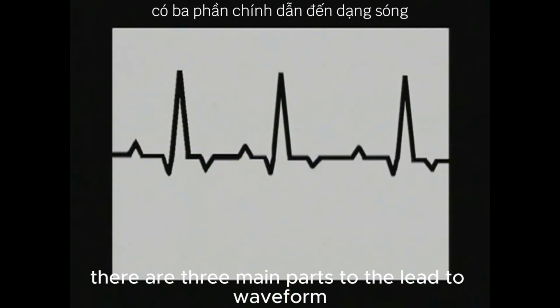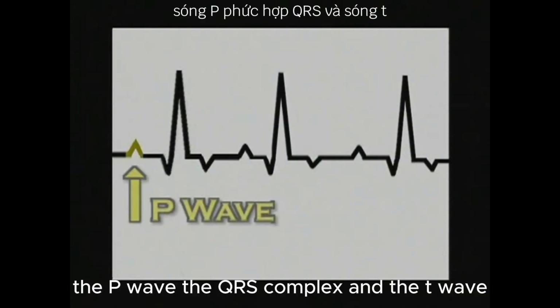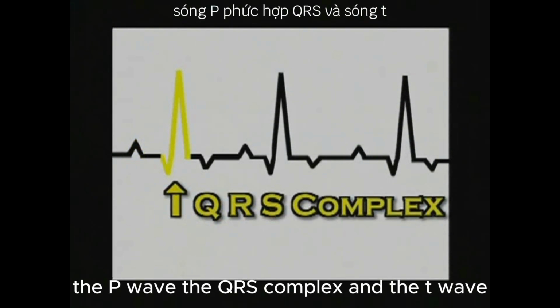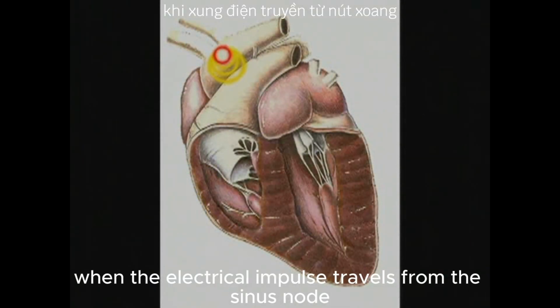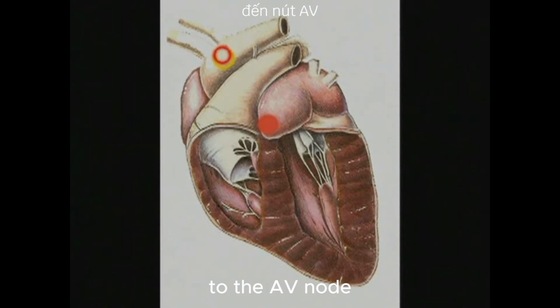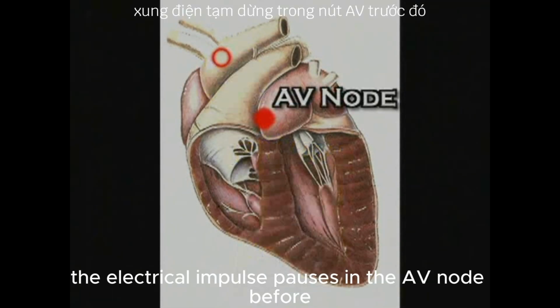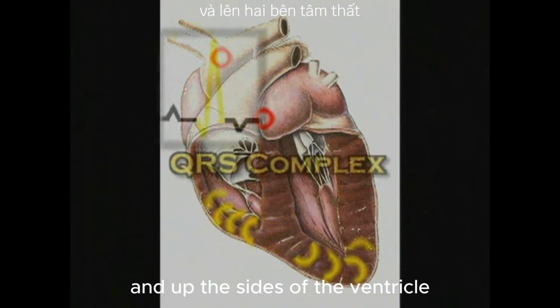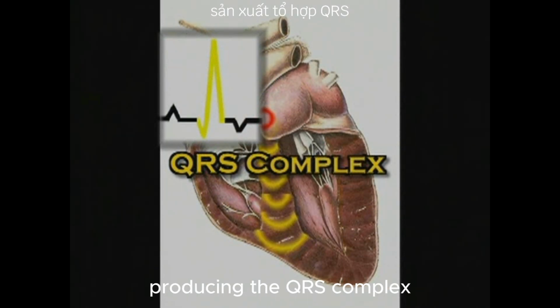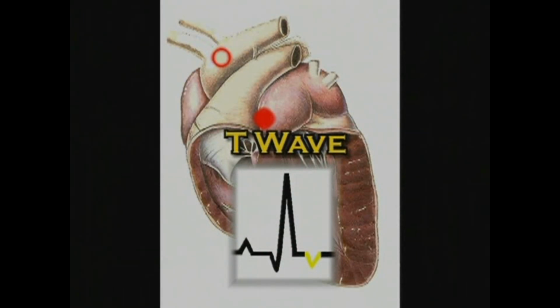There are three main parts to the lead 2 waveform that represents a single heartbeat: the P wave, the QRS complex, and the T wave. When the electrical impulse travels from the sinus node to the AV node through the atria, the P wave is produced. The electrical impulse pauses in the AV node before continuing down the interventricular septum and up the sides of the ventricle, producing the QRS complex. During repolarization, the T wave is produced.